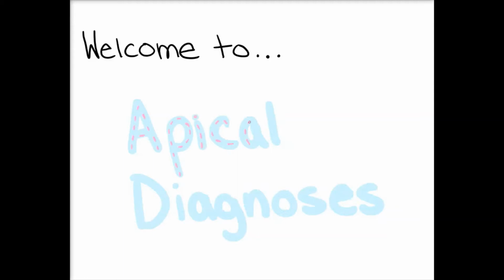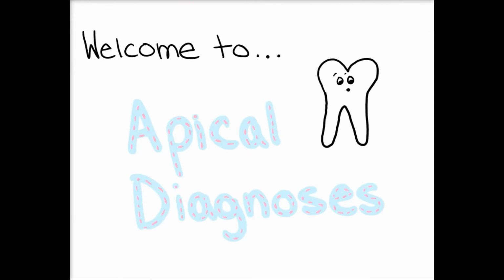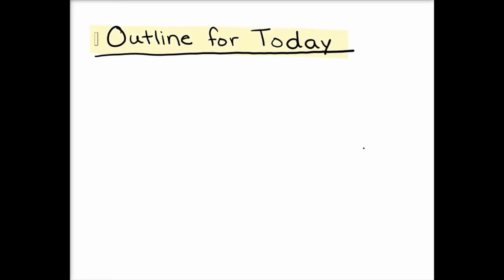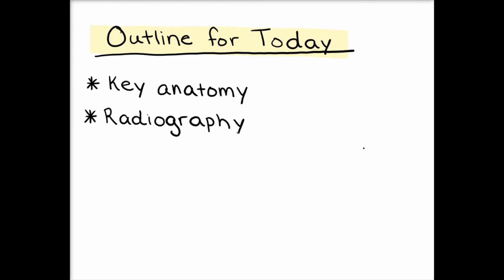Welcome to Apical Diagnoses, another introductory video on endodontics by me, EndoGal. Today we're going to go over each of the possible apical diagnoses, but first we'll need to review some key anatomy, how to read radiographs, and then finally we'll get into determining a tooth's apical status. So first let's look at some key dental anatomy.